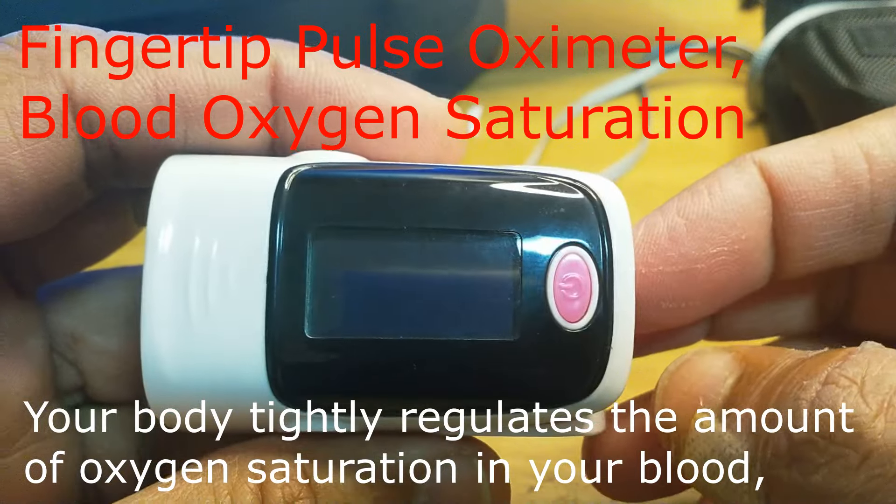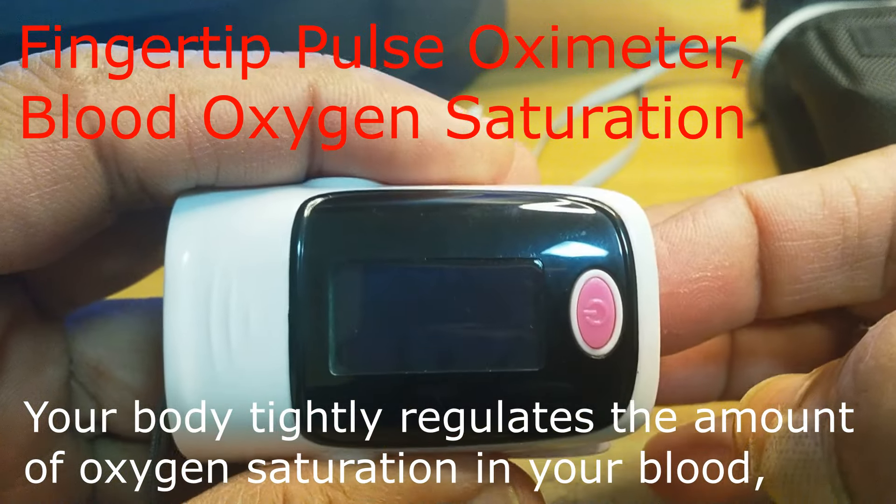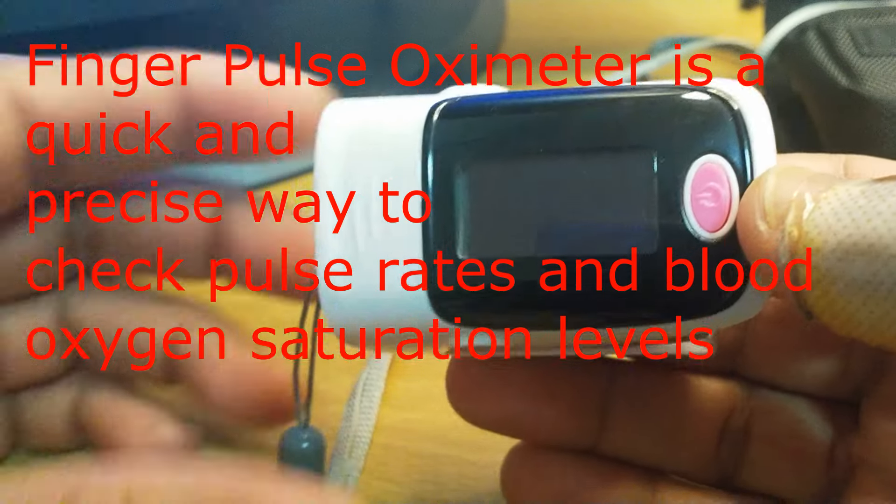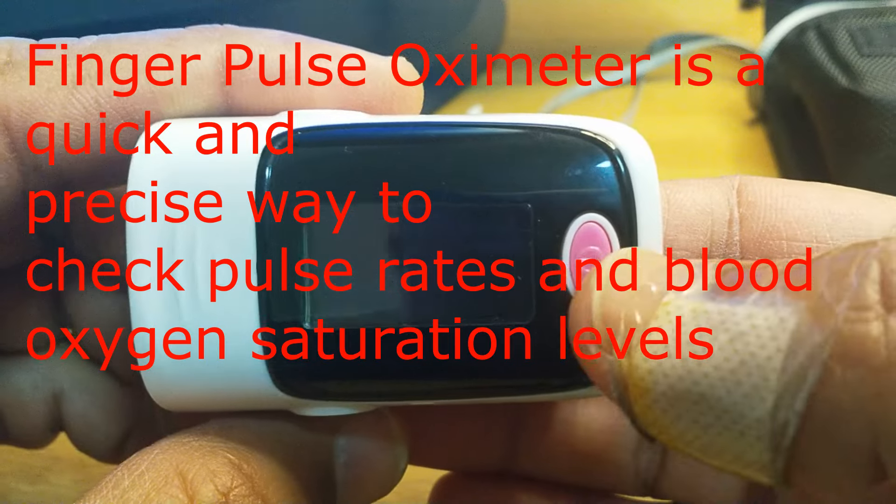Today I will show you this fingertip pulse oximeter and its functions. The oximeter measures SpO2 — what is this? This is the oxygen saturation in the bloodstream.